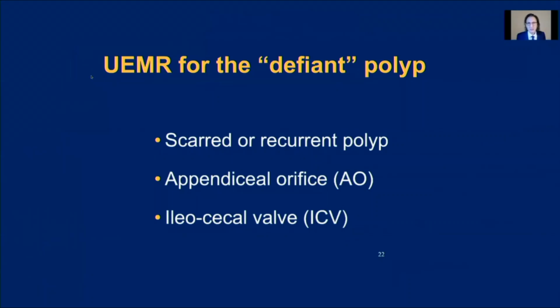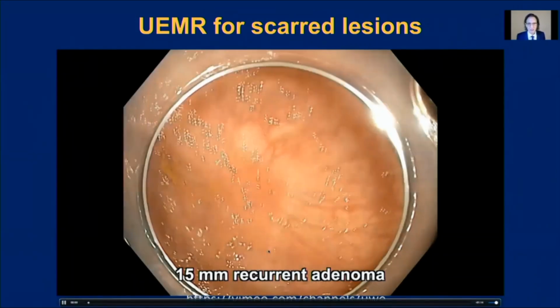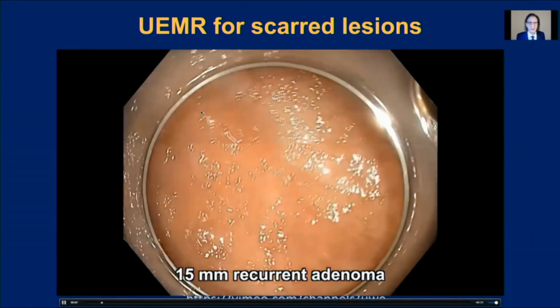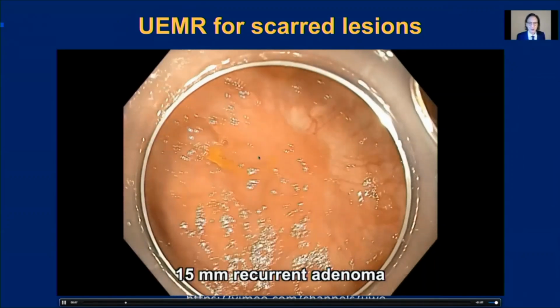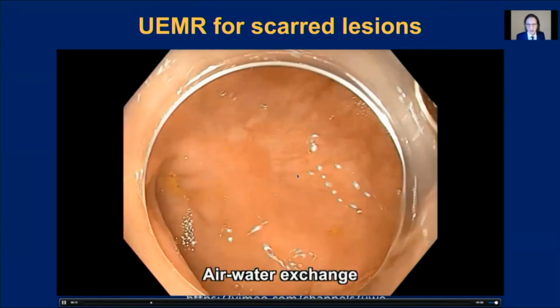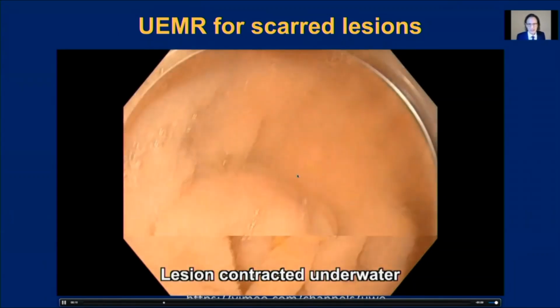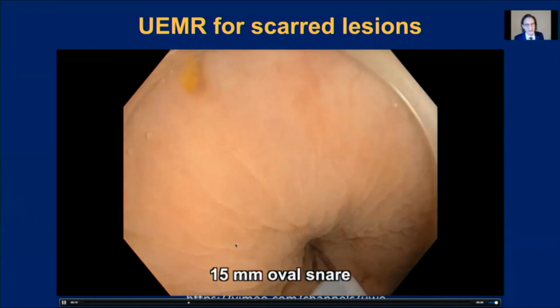UEMR is increasingly being reported for the treatment of so-called defiant polyps. So here you can see, just to illustrate, the application of UEMR for a scarred lesion, 15 millimeters. This is a recurrence here. You can see the recurrence in this area right here, and it's very scarred. Actually, it's much larger. Here's the perimeter. So you have to look very carefully to appreciate the extent, but you see it much better underwater because it floats up and it contracts.